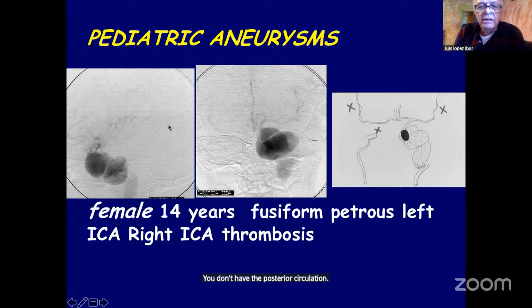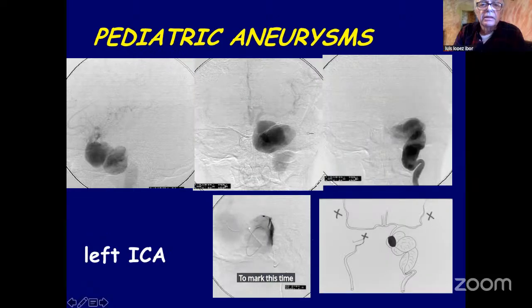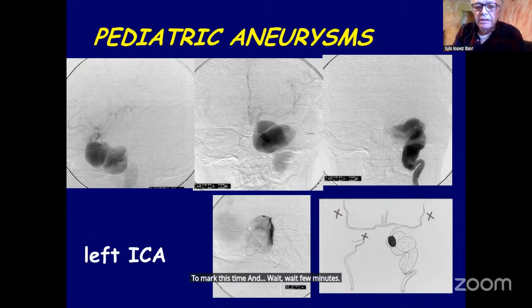I decided to navigate the balloon to mark distal, and wait a few minutes. The patient is under neuroleptoanalgesia. It's possible to check.